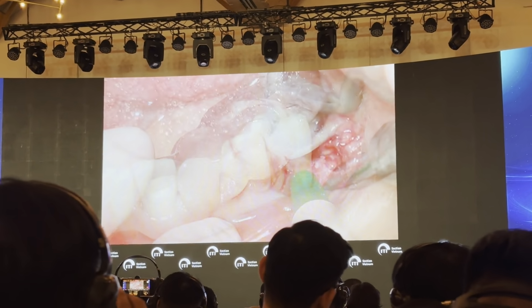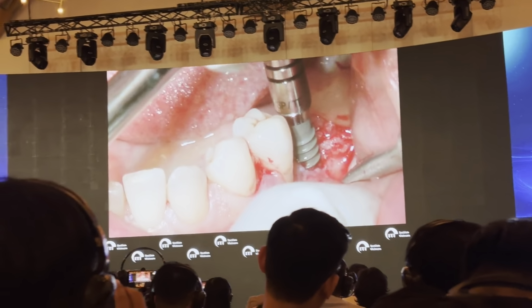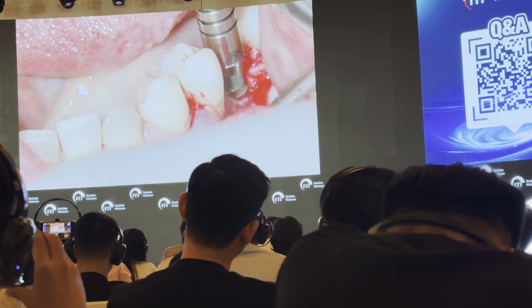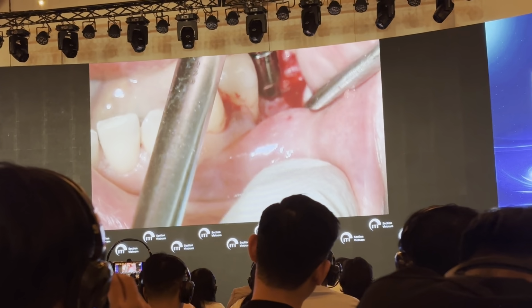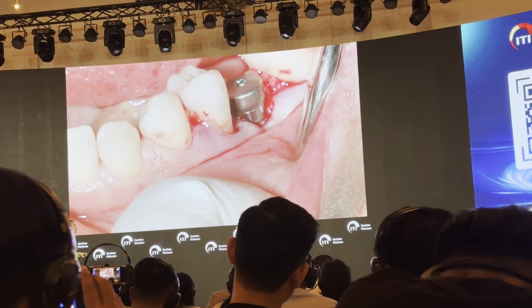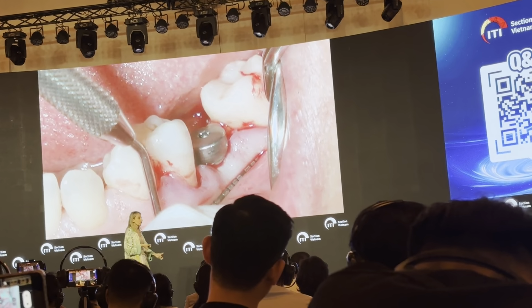because otherwise we will increase the amount of buccal dehiscence that we already know is going to be formed after this implant placement, a small amount of buccal dehiscence with a thin remaining amount of buccal bone. But again, this is going to be not a problem at all, since we are going to increase the soft tissue thickness.